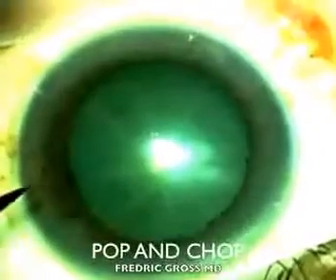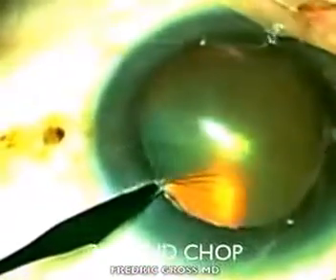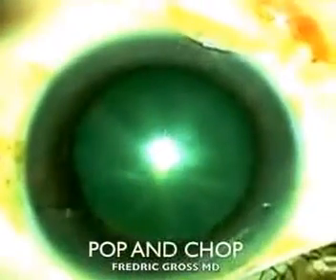In this video, I present an alternative method for removing the nucleus during phacoemulsification surgery.